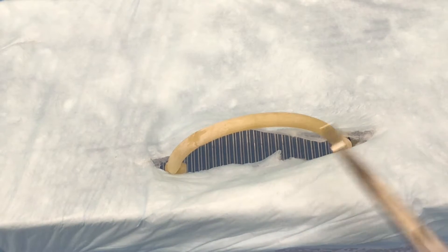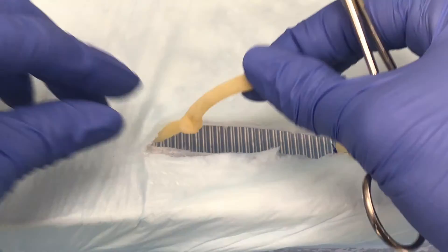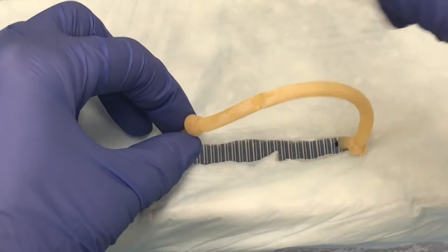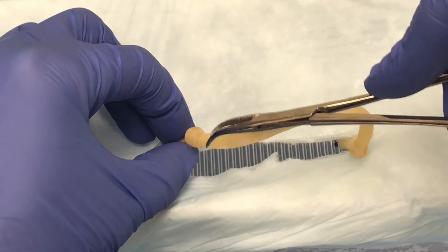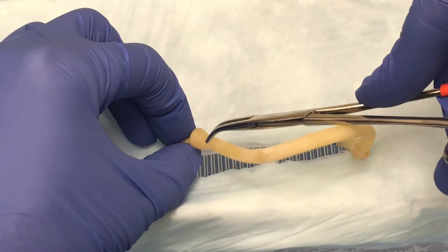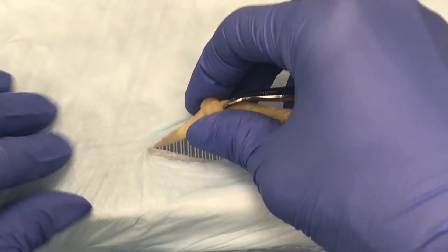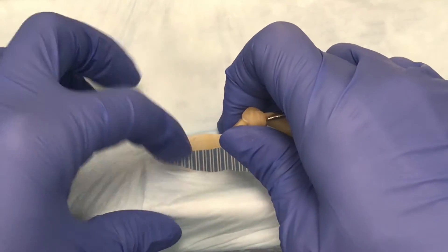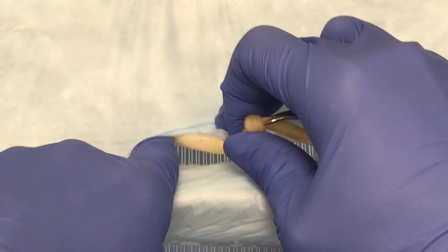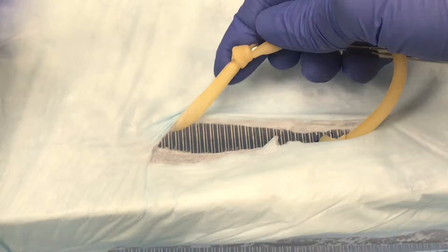Cranial is this way, caudal is this way. What you're going to do is put some traction on your ovarian pedicle initially by putting a clamp on the proper ligament, then holding the clamp and the ovarian one to pull. You'll be reaching down in, breaking down the suspensory ligament and leaving behind your ovarian pedicle.